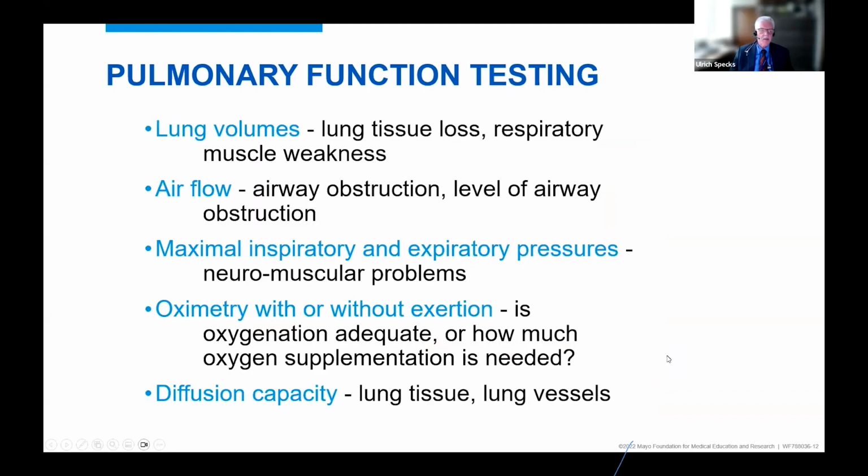And these lung function tests do several things. They give us numbers about the various volumes of the lung, how much you can breathe in and out, how much air is in your lungs, how much air is in your chest, and that can tell us about lung tissue loss as well as respiratory muscle weakness.